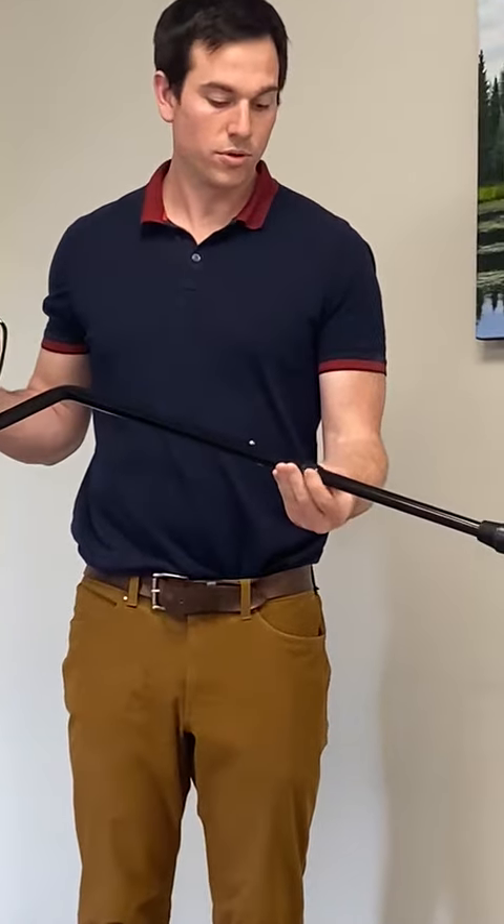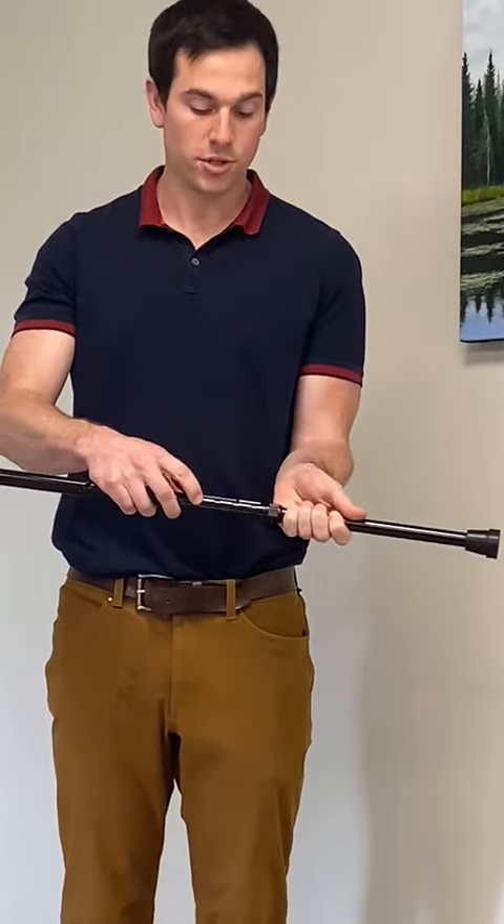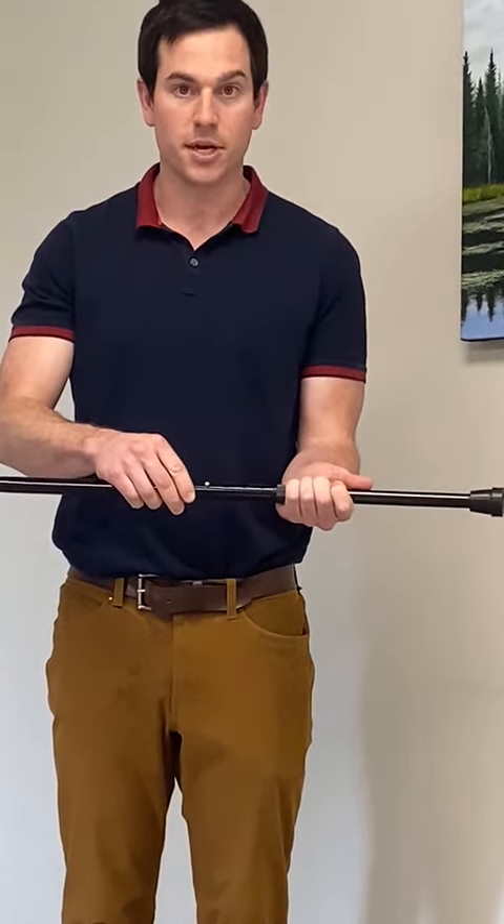You unscrew the little snap there and then you can easily adjust it by pushing in the silver button and sliding it up and down.